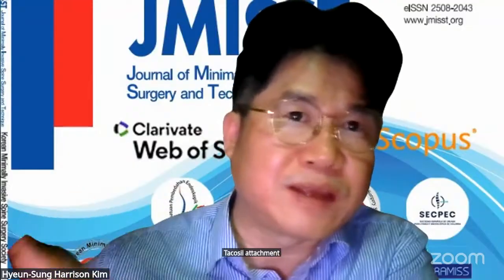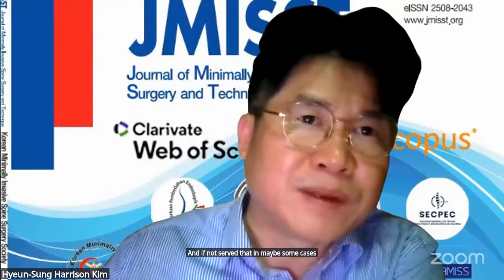I already published that paper in World Neurosurgery. Very easy. Attach the TachoSil to the dural tear area, and the dural tear is solved very easily. If it is not solved, in some cases we may need to convert to open surgery, but usually that does not happen. Usually it is managed by the TachoSil attachment.